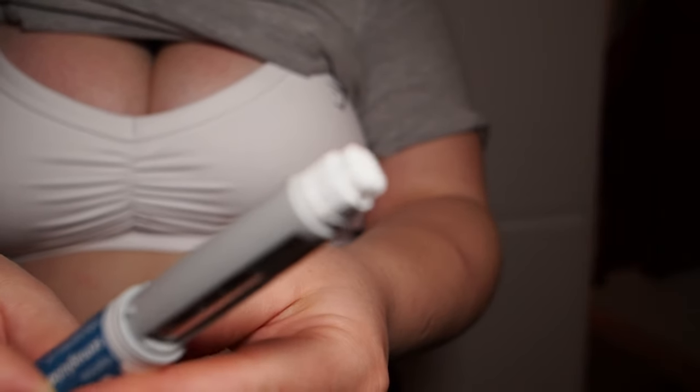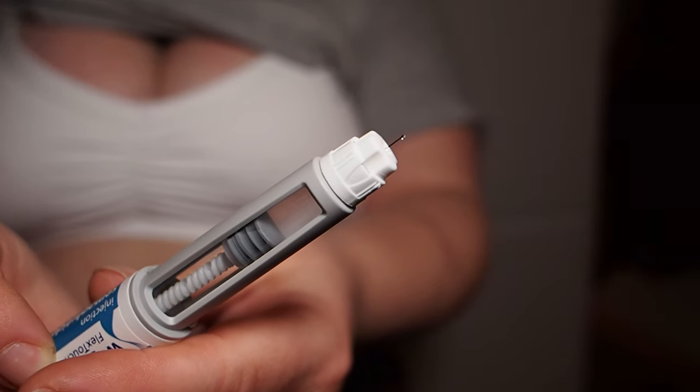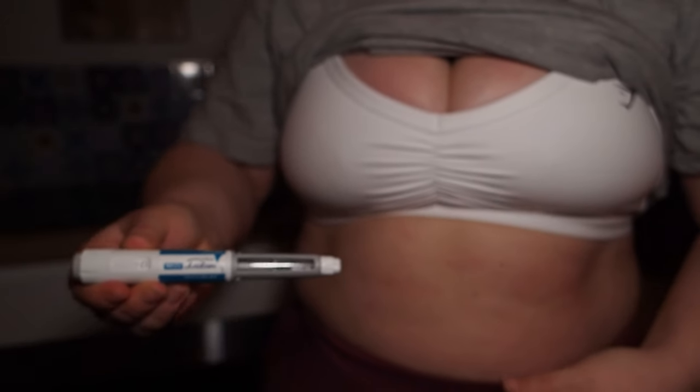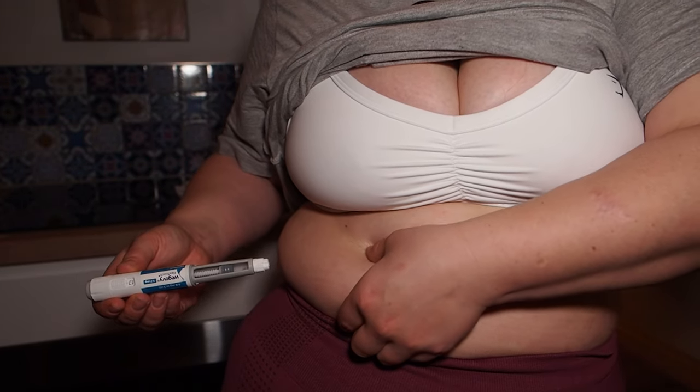Take off the two caps and it should have the little needle poking out the end. Make sure it's not damaged. It might have a little bleb at the end of it and that is completely fine — it's not wasting any of the medication, it's literally the tiniest amount.